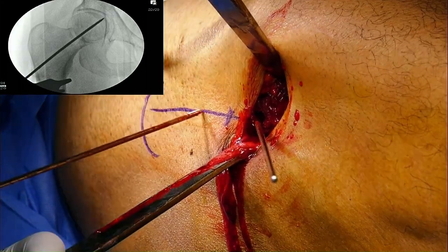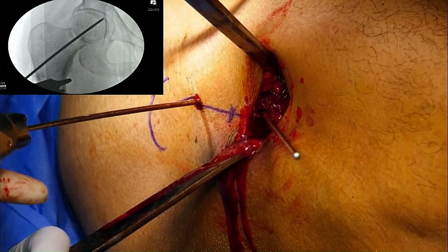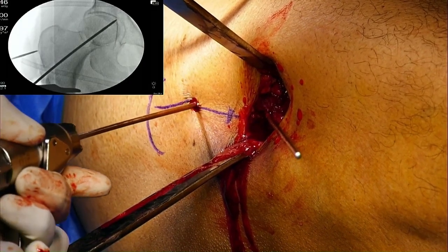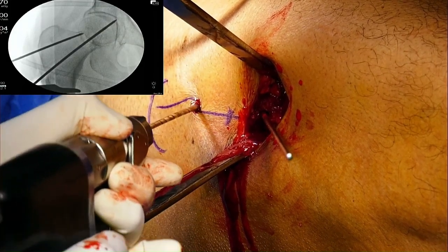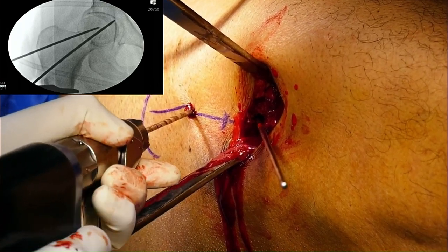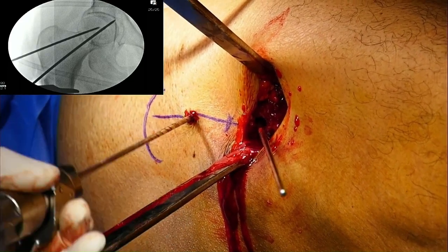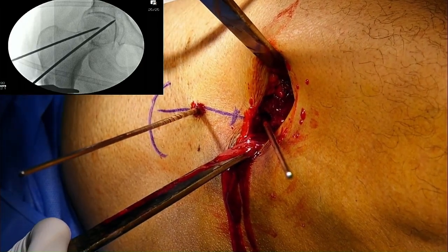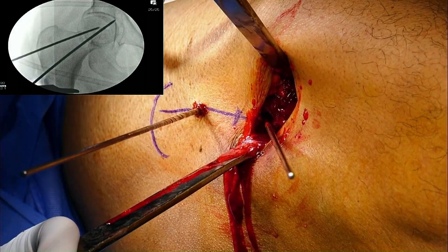I'll keep — not through the wound, I just pierce the tip — as long as it goes from the trochanter into the head, I am happy. Shoot. Okay, I'll accept it at this stage because to prevent the spinning it's working, but we have the derotation screw as well. This is the derotational pin. Now I will use the triple reamer and do the triple reaming.